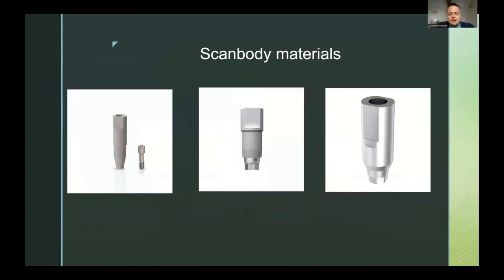Regarding scanbody materials: on the left you see a scanbody made of PEEK, a soft material that is very easy to scan. However, being soft, it is prone to deformation when seated inside the implant and also prone to deformation after multiple sterilization cycles. This is why PEEK and other soft-material scanbodies are mostly good for a single impression, and then they need to be replaced. In the middle is a scanbody made of metal combined with PEEK or another plastic-like material so it can easily be scanned.